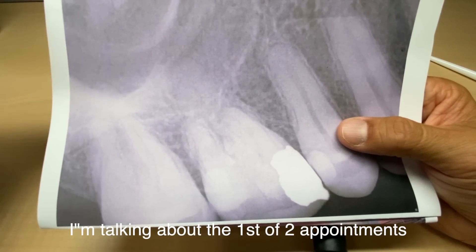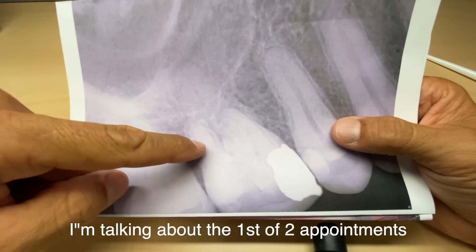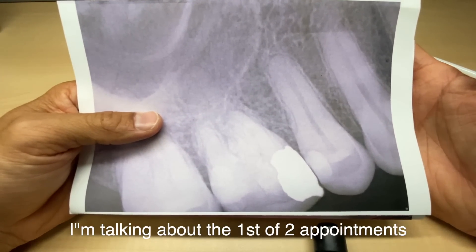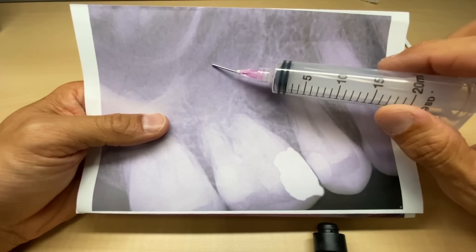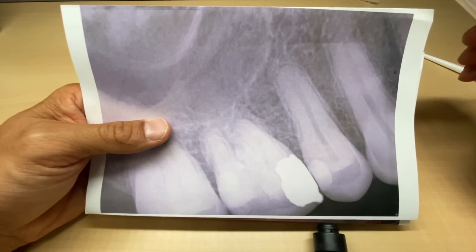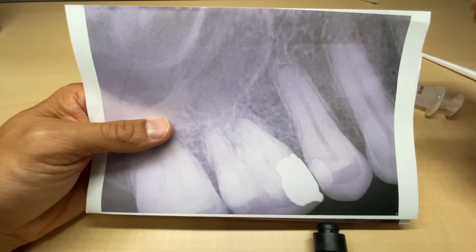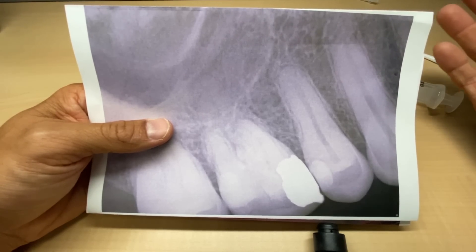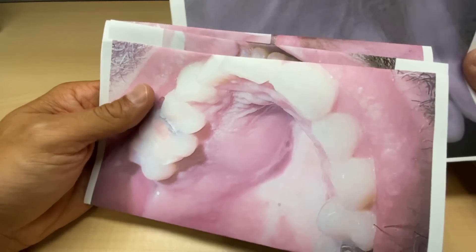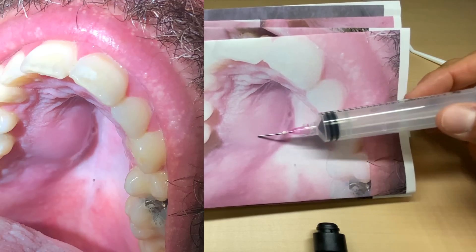This case presented to a clinician; the diagnosis was necrotic with symptomatic apical periodontitis. MB2 was found — if you're wondering, that was a problem. On the initial PA, it was really hard to see the lesion. A CBCT is more ideal, but in an emergency exam the diagnosis was made and the pulpectomy was completed. All four canals were clean, shaped and good to go. The patient presented four days later and a palatal abscess showed up.